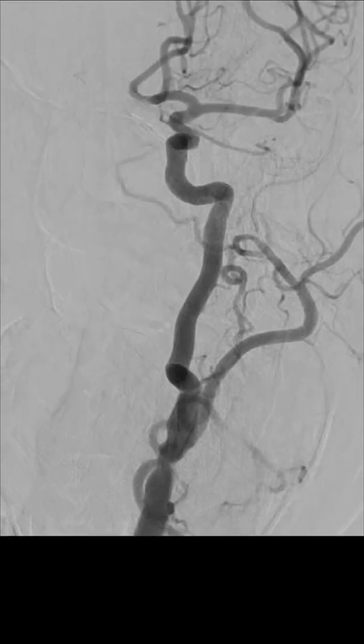Another view. So when there is a doubt, you have to take different views. Which is the view in which usually the carotid stenosis is clearly seen? It is in the lateral view, not in the AP view. In the AP view usually the external and internal will lie one over the other, whereas in the lateral view you can open up the bifurcation and see the stenosis much more clearly.